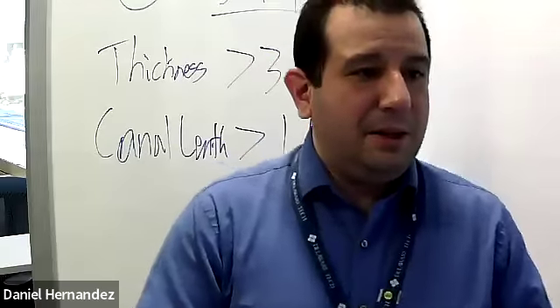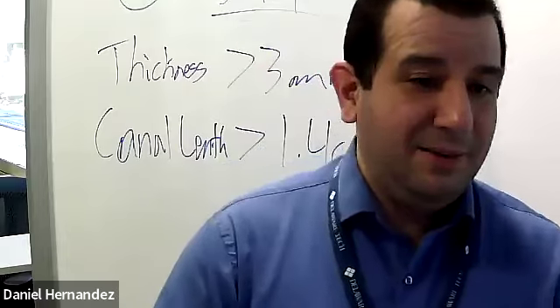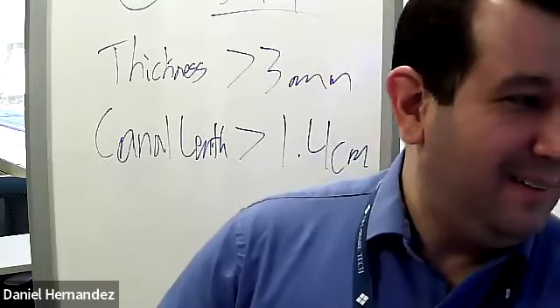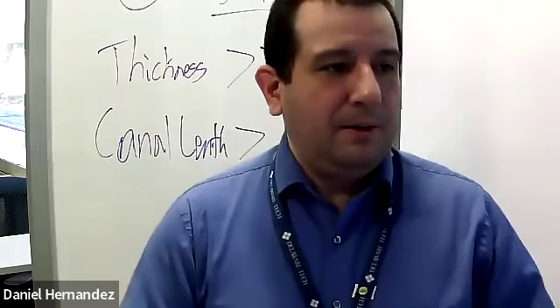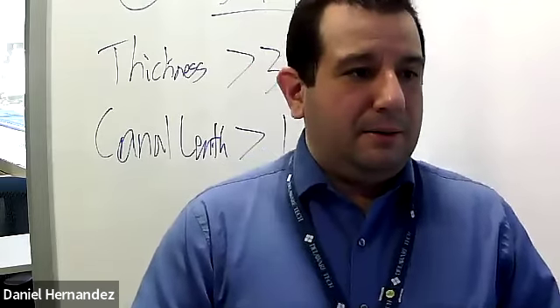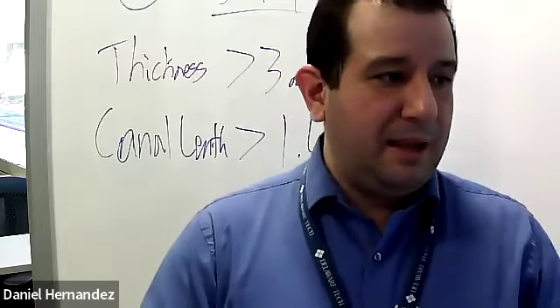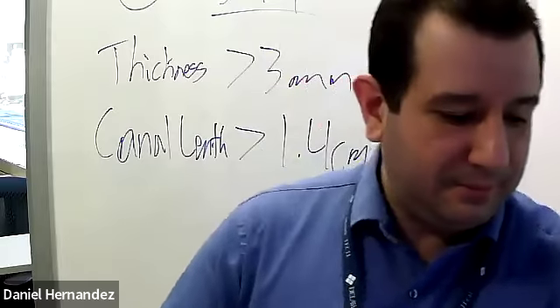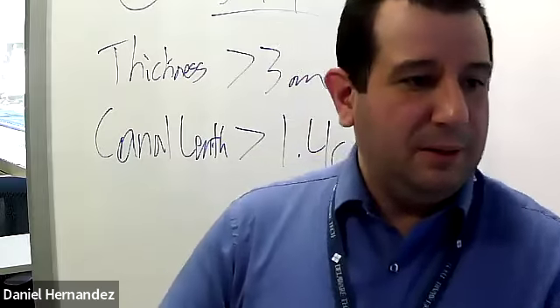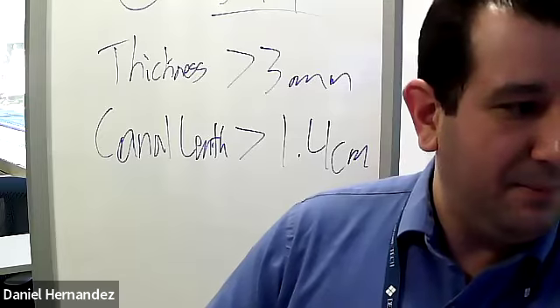So if the muscle is thickened and elongated, the mucosa extends into the antrum. This appearance has been called the cervix sign. It does kind of look like a cervix, I agree with that. Again, we're measuring just that hypoechoic muscle to its junction with the echogenic central canal. Pyloric channel length is measured from the proximal to the distal extremities of the echogenic central canal.